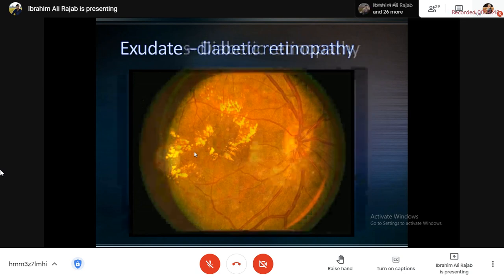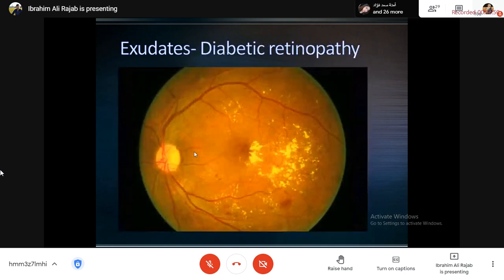Yalla Amin Karim, can you describe this image for me, please? Doctor, clear margin of the optic disc. Right.